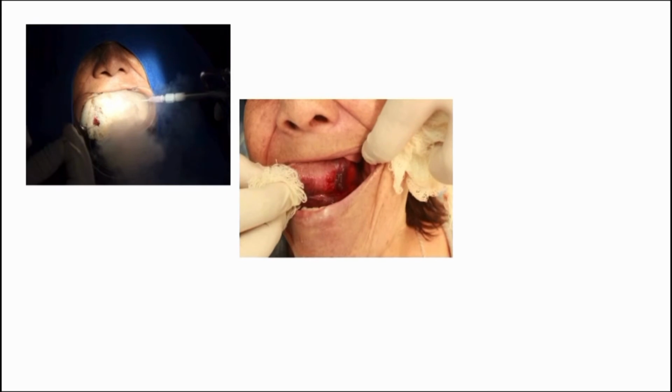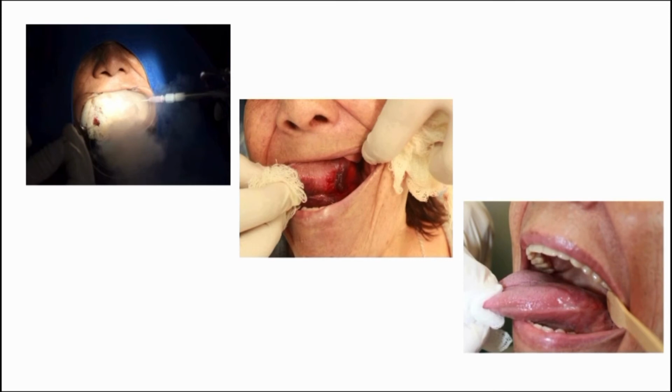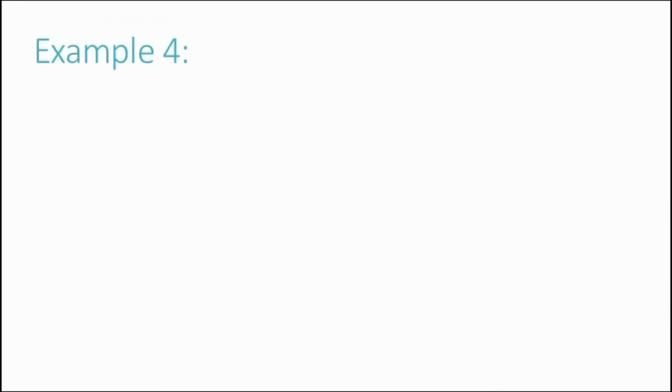Liquid nitrogen spray cryosurgery was performed. We apply it in 2 cycles, each cycle 1 minute long, with a 2 minute interval between the cycles. This was the result directly after the cryotherapy. We see edema and erythema in the area, and this was the result after 6 weeks of follow-up.